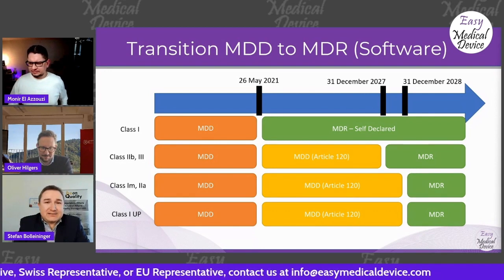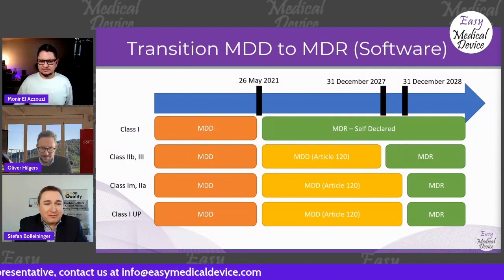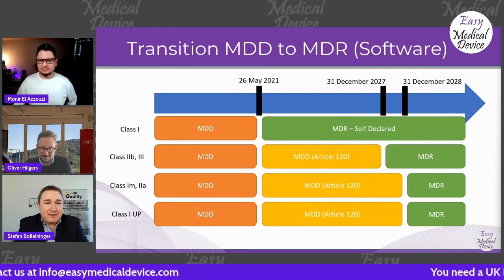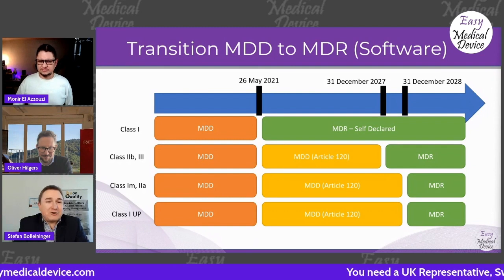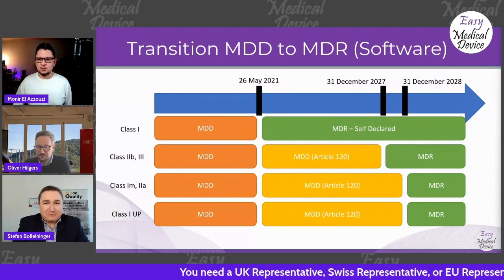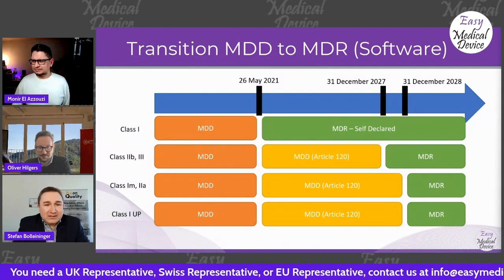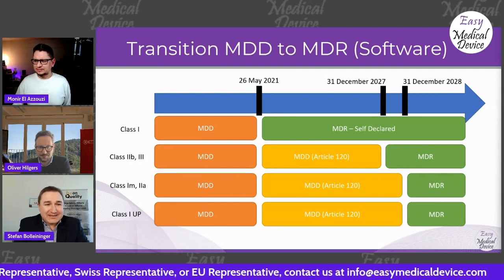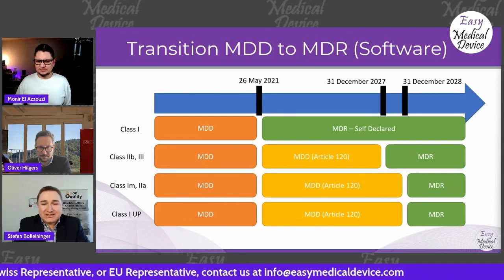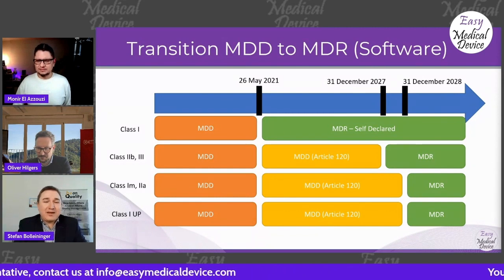Unfortunately, I also had some companies being sued for saying they have a certified class 1 medical device, because it's not a certified device. Exactly. As we say, words are really important. So thanks for clarifying that. Even if we all know what we mean by that, there are unfortunately so many bad people out there.